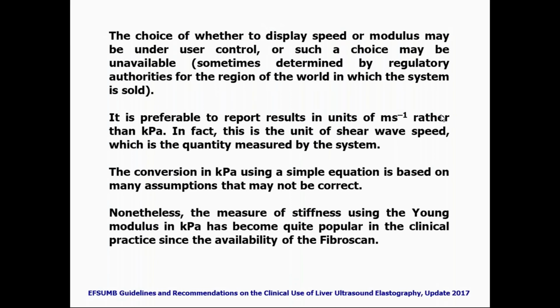The choice of whether to display the speed or moduli is under user control in the majority of the equipment. In some cases, this choice may be unavailable. It may also depend on the regulatory authorities for the region of the world in which the system is sold.